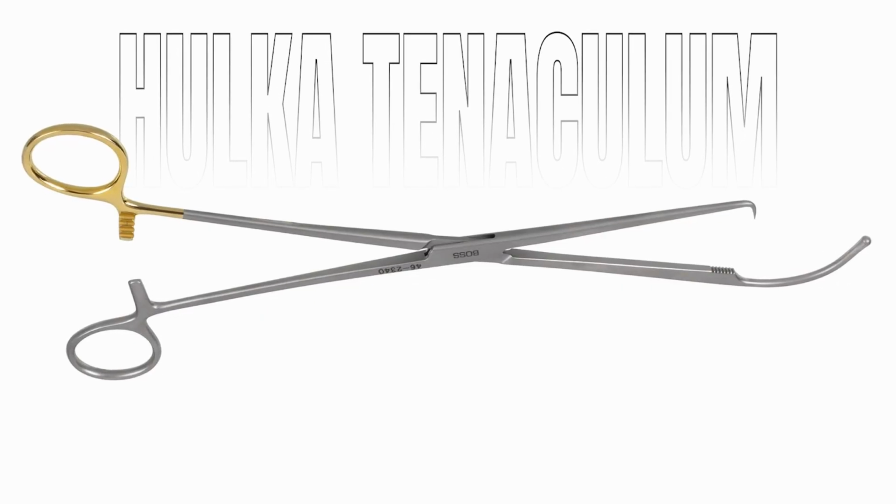Scary instrument number 6. If you are a Marvel fan, some of you might really like the Hulk. Strong, unpredictable, causes a lot of damage. Not exactly the name I would use for an instrument in GYN. Say hello to the Hulka tenaculum. This nasty instrument is made to clamp onto the cervix and be used to manipulate the cervix around. Ouch. That's gonna hurt when you wake up.